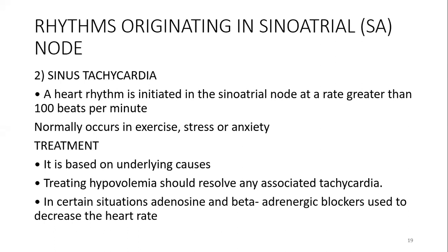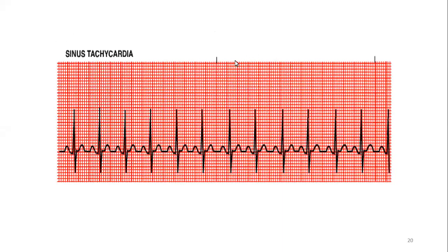So this is an ECG strip again. Using the same method, from this first black line to the second black line is 6 seconds and about 30 large boxes. So just simply count the number of R waves you have within there. 1, 2, 3, 4, 5, 6, 7, 8, 9, 10, 11, 12. So 12 times 10, 120 beats per minute.